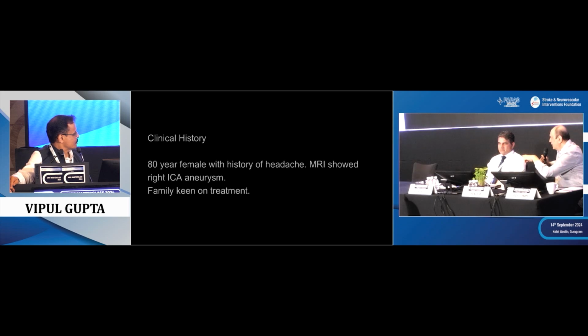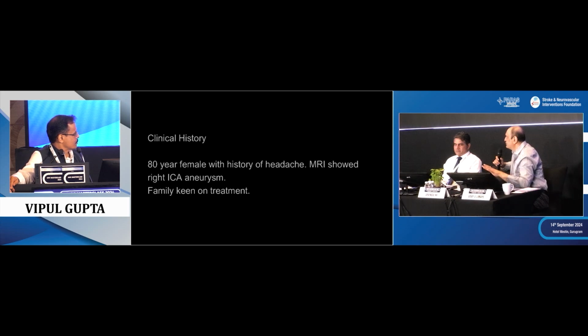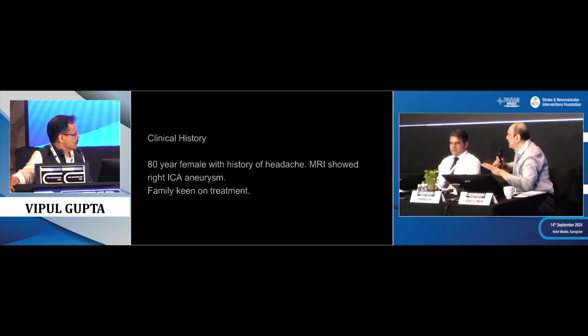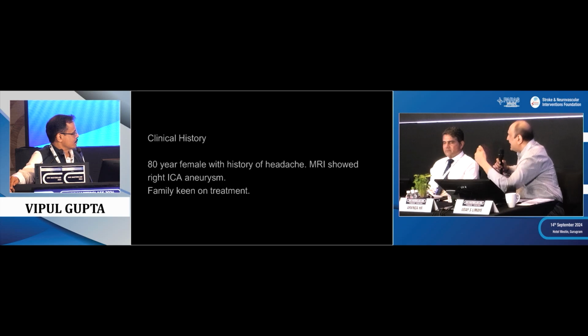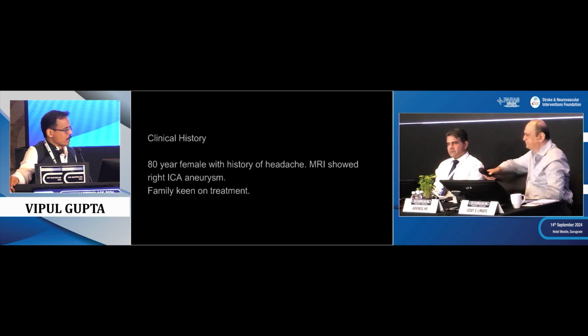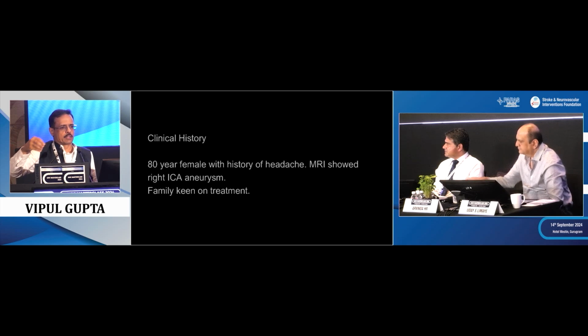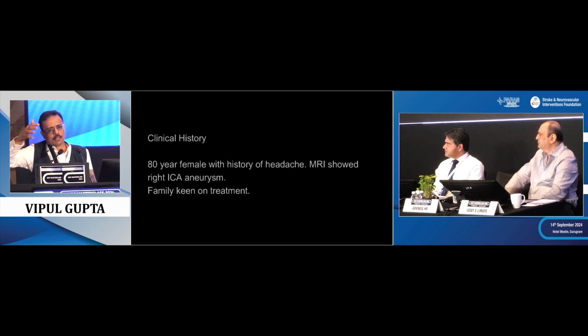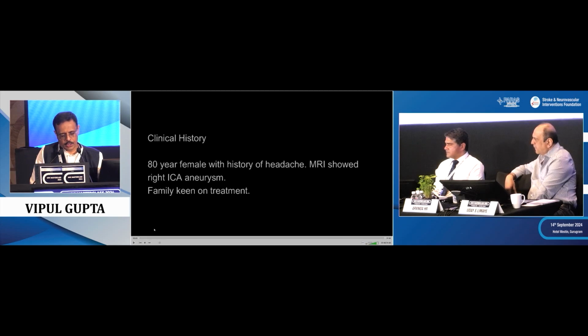of synchro, we have a very low threshold of shifting to the hybrid 7J. Absolutely atraumatic, it is fully J, curved on itself, and it's never going to catch something or perforate. So that's a great thing again. Please don't use regular wires, whether we use synchro 10, sometimes we use hybrid, it's that J wire. Be very conscious, these are smaller vessels which we may cause injury pretty easily in these situations.